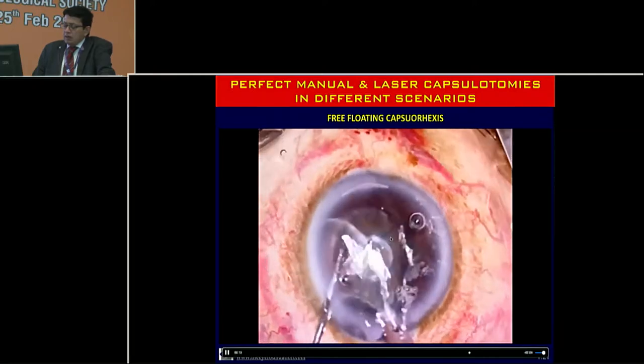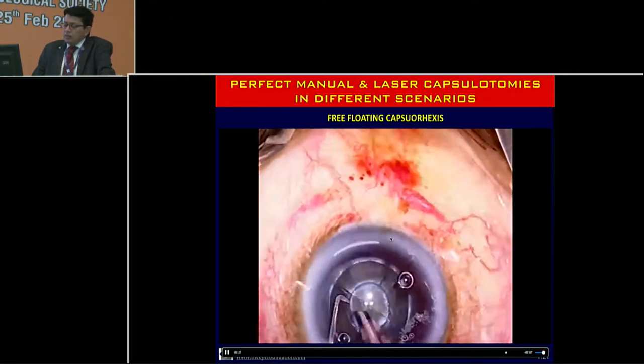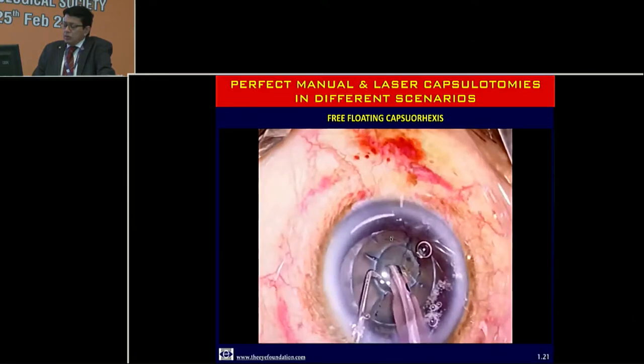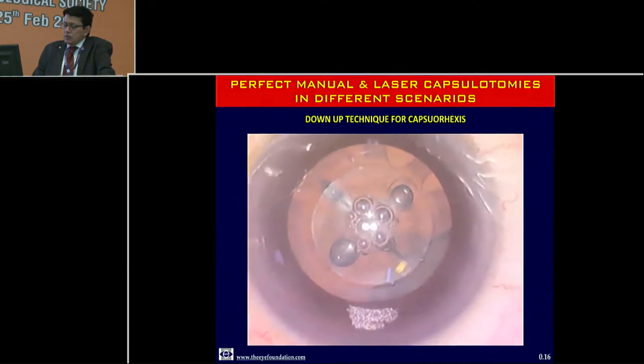I'll shift gears to what I do with femtosecond lasers. Here is a routine femtosecond laser case — you can see the capsulorhexis coming on. Because of the contour-guided capsulotomy inherent in this system, most often you get a free-floating capsulorhexis. All you need to do once you go in with the phaco probe is let it float out — though that's not always the situation.